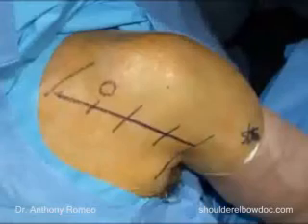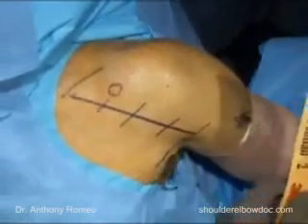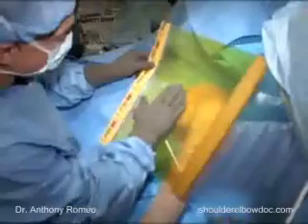We'll go ahead and take an Ioband drape. The Ioband accomplishes the task of holding our drapes in position throughout the surgical procedure and helps improve our sterile barrier against any type of infection or contamination. We'll then finalize our draping, sealing off from the anesthesia team.